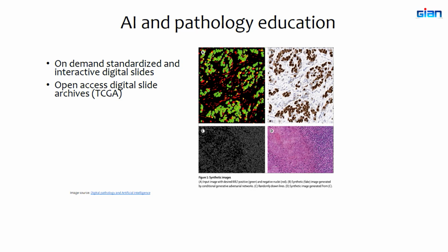So I think they have a collection. Last I checked, they had a collection of over 11,000 or 12,000 whole slide images, and this spanned multiple different cancers. So they have a very good interface. If you want to, let's say, look at only brain cancer, you can go there, you can build your own cohort for a particular cancer type you need.